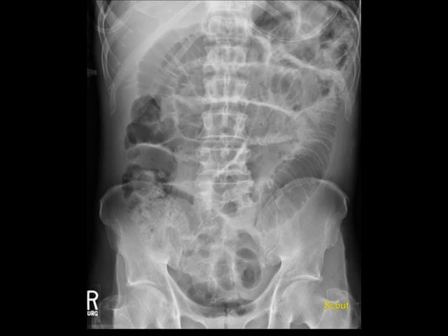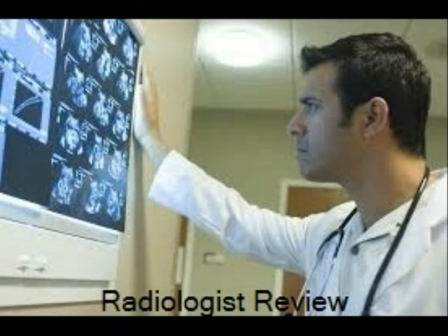All abdominal images in this study are taken on 14 by 17 cassettes or films and marked in the inferior corner with a right marker on the patient's right side. This image should be centered to the level of the iliac crest and annotated or marked with lead markers as a scout image. The scout image is then sent over to the radiologist for review. He will decide after looking over the scout image if the exam should continue. The radiologist may decide not to continue the exam if the patient hasn't been adequately prepped.